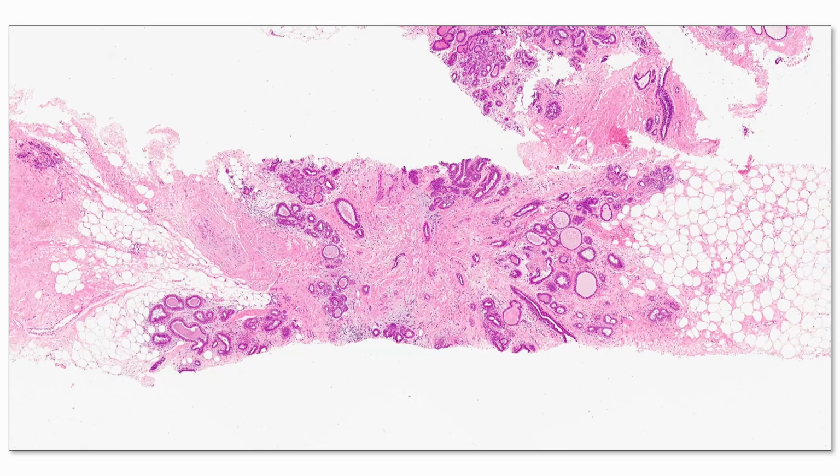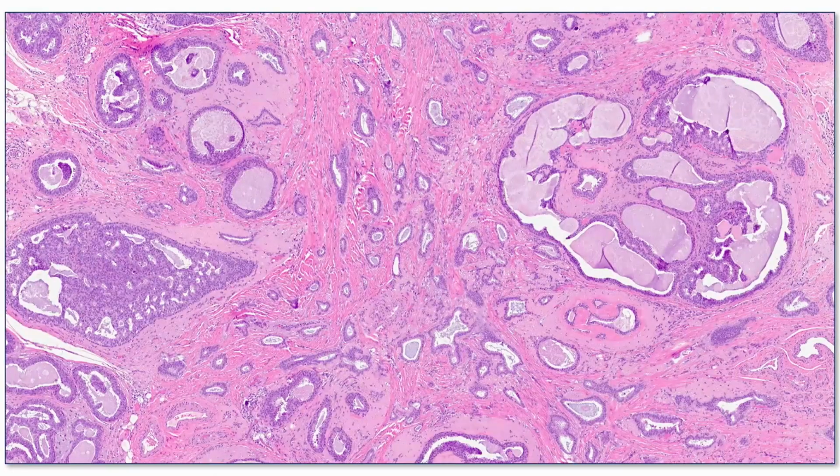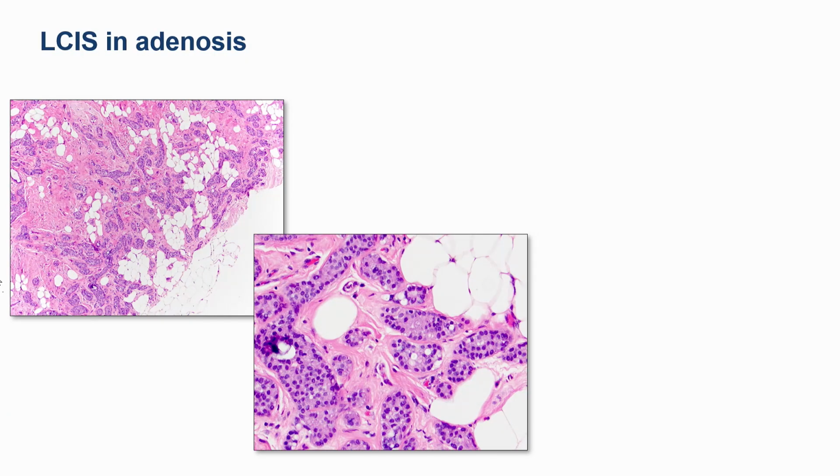Here, again, another radial scar, similar entrapped glands, but these elements radiating out. So you really have the architecture, which may not be as easy to appreciate on a core biopsy, of course, depending how the needle goes through the lesion. Here, contrasting with a tubular carcinoma where you have more haphazard arrangement of the glands, they're infiltrating out beyond any central nidus that you might be imagining. As well, there is epithelial atypia in the intraductal or in situ component.